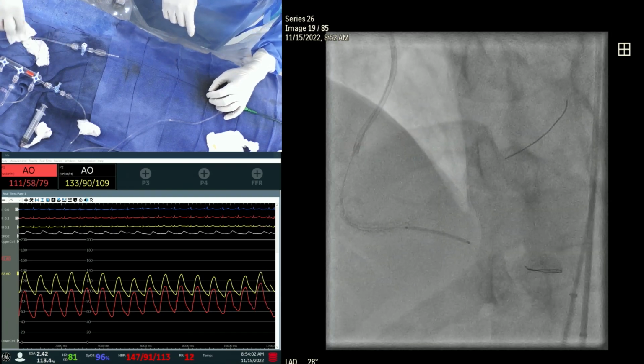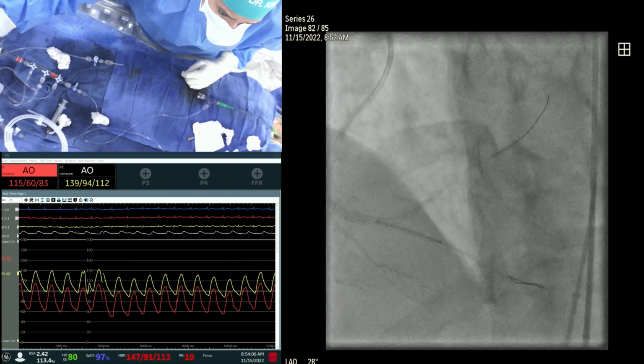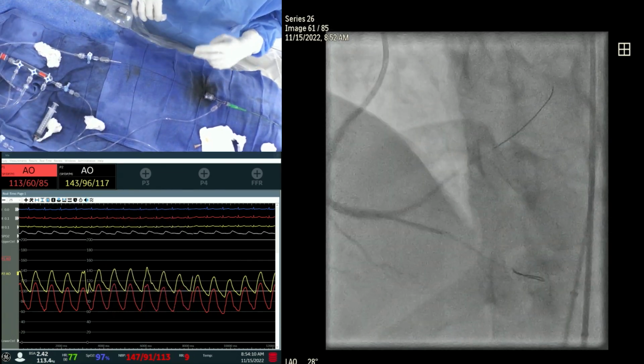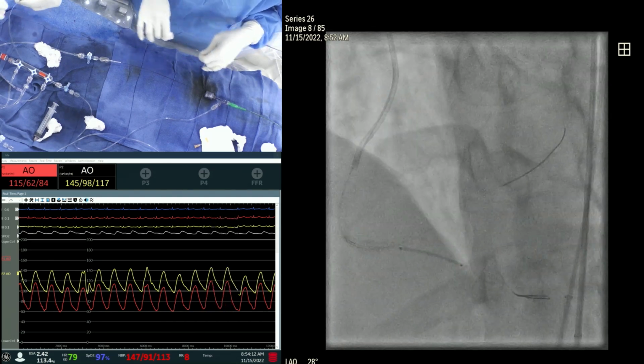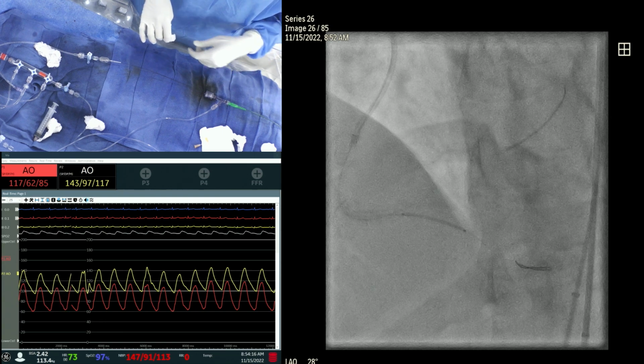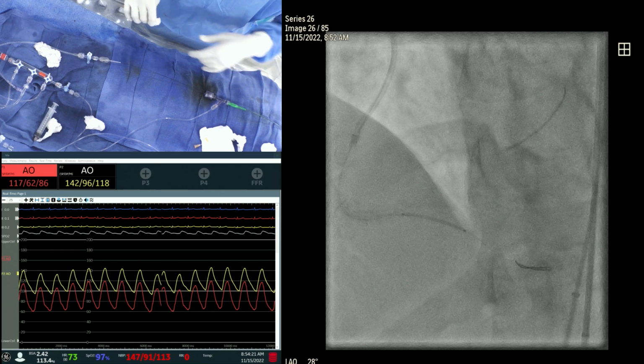Okay, we're doing a mini crush through the 6 French. It's not 12. 12. Yes, 12. As long as the ostium is spared, that will be the goal. If need be anything further, you can always do it. If you have trouble advancing, then we come out. But if we can advance 2 of them, we go. One second. Wait. I'm pulling it.